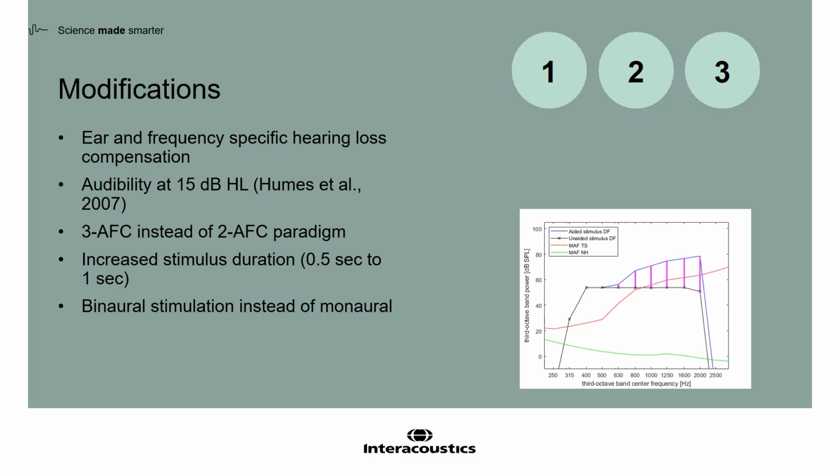Finally, during these evaluations, IRU decided to go with a binaural stimulation instead of a monaural stimulation, increasing the ease and accuracy of the test, as well as improving the correspondence with real-world speech and noise listening situations.